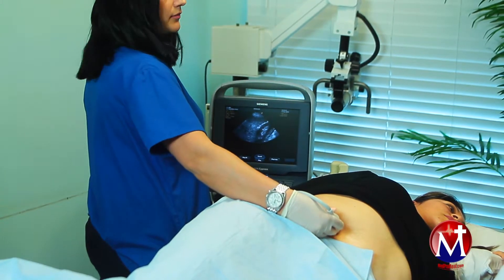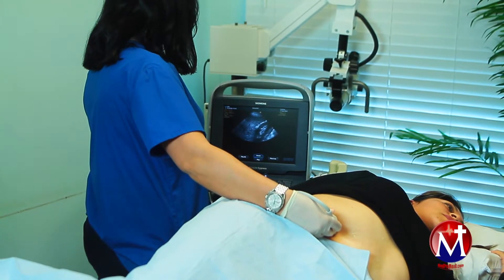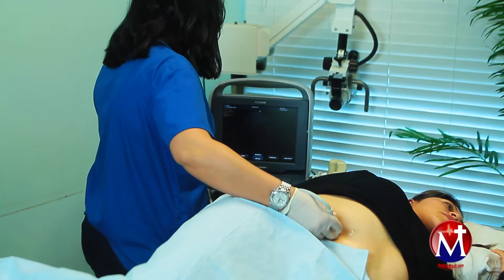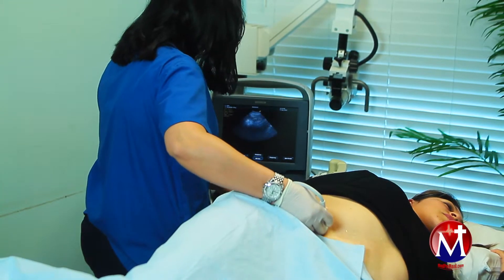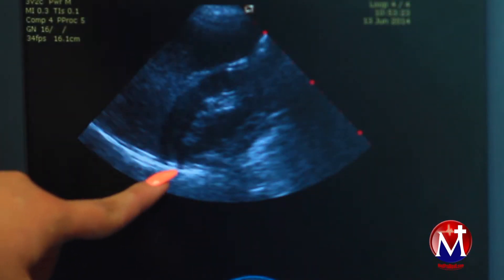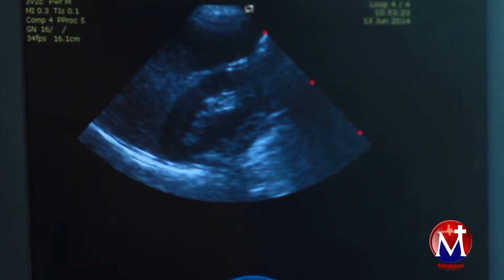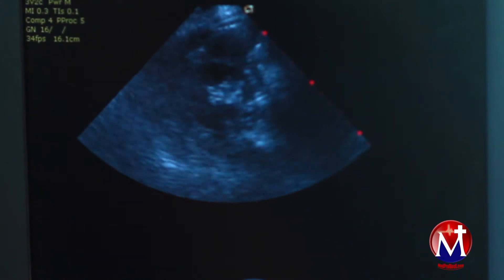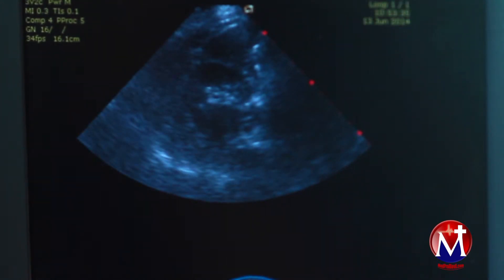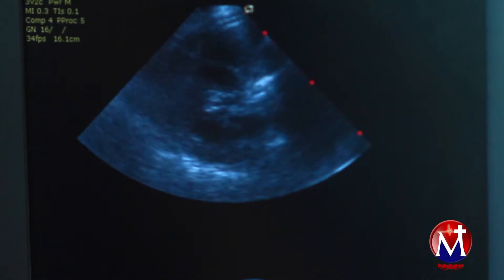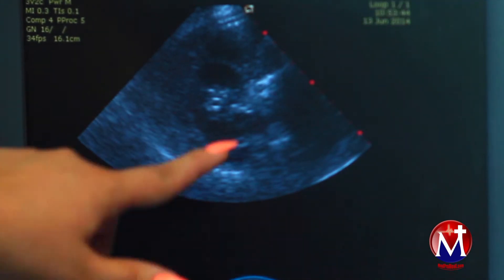Layla is now showing an image of the right kidney, which lives just below the liver. Ultrasound is very sensitive in detecting obstructions to the kidneys such as hydronephrosis and kidney stones. Renal infections or surrounding fluid collections are also easily seen. The texture and size of the kidneys are assessed, which is very important in patients with hypertension and diabetes who may have underlying renal function disturbances.